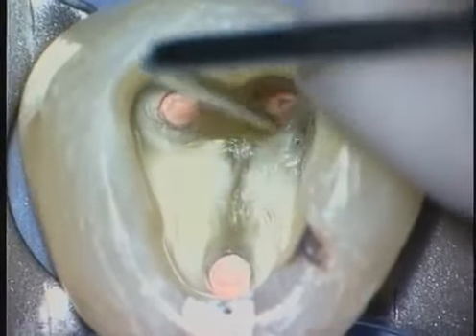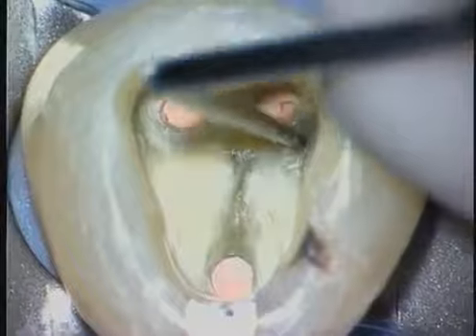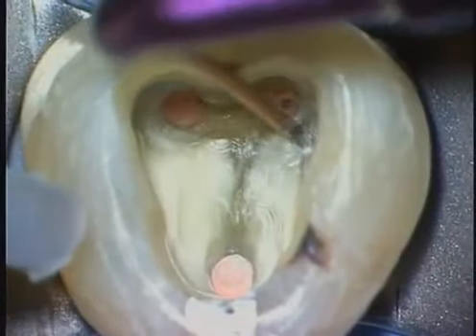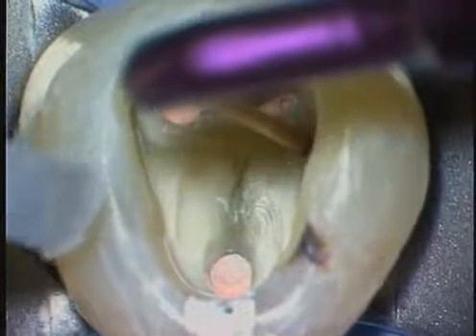Just about 2 millimeters mesial and lingual to the ML system is a catch. Ultrasonics removes a lip of secondary overlying dentin, and rapidly we have access to another system. Transillumination with fiber optic lights reveals this system. In retreatment, there's never just one obstacle, but usually a series of challenges that needs to be overcome.